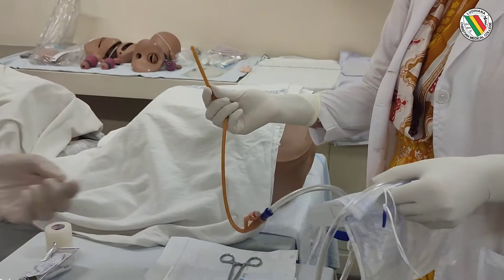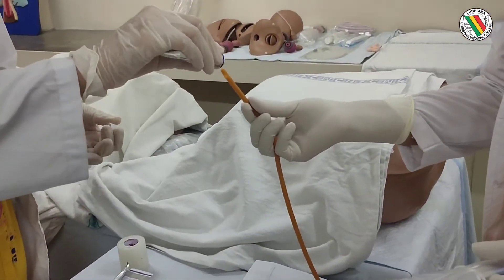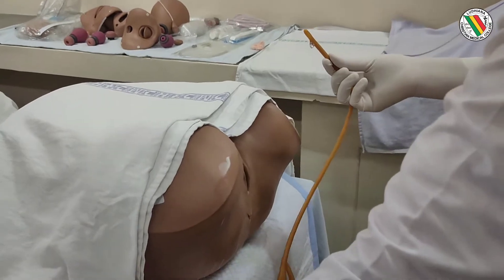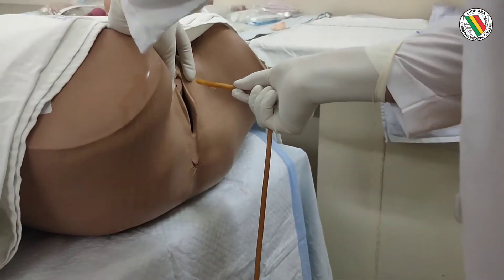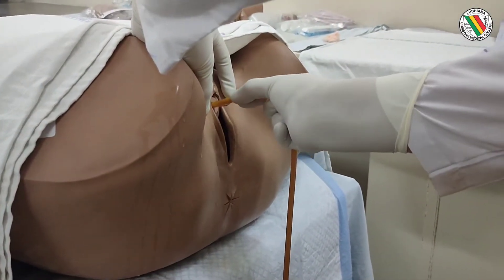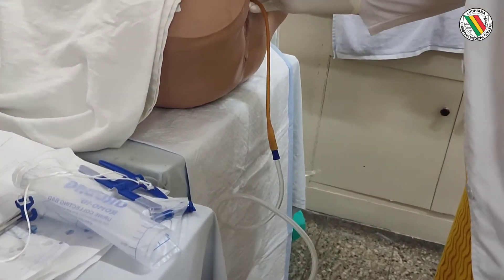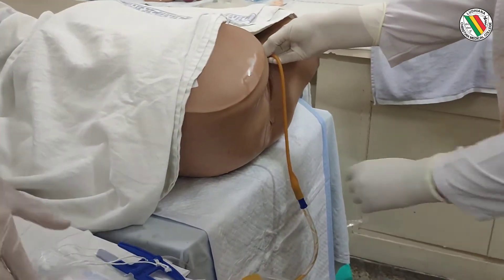Lignocaine jelly is applied at the tip of the catheter, and then we need to introduce it into the urethral meatus. The left hand holds the labia apart while the right hand introduces the catheter into the urethral meatus. Once it is inside, you can see the urine flowing into the urobag, which confirms it is in place.